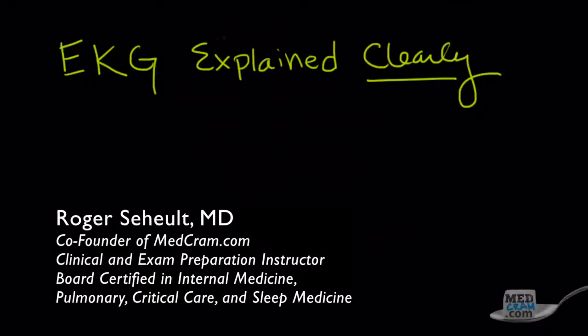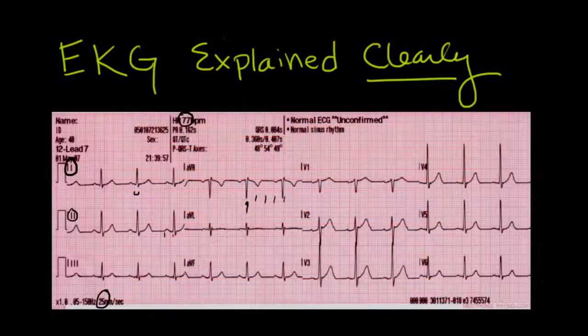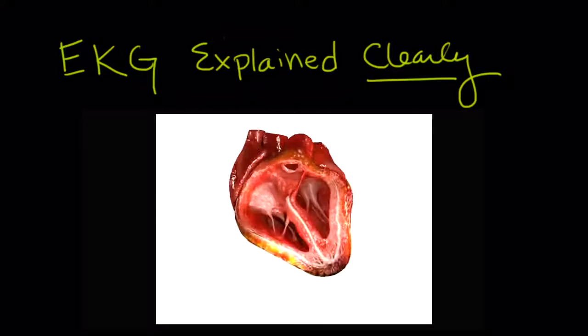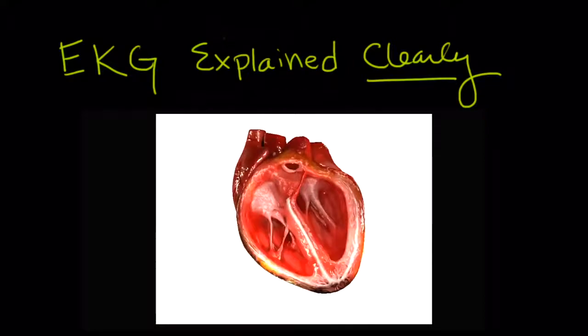By the end of this course, you'll have all the skills needed to confidently interpret EKGs in a systematic way. You'll understand the electrical activity represented on EKG paper that allows the heart to beat and cycle blood through our lungs and bodies. This is the final product.